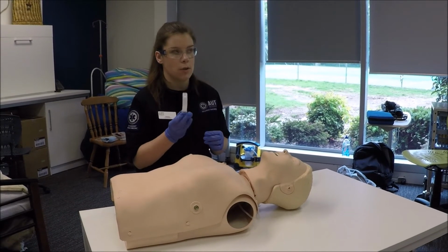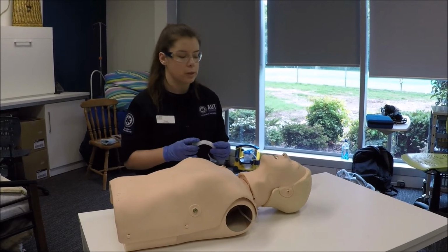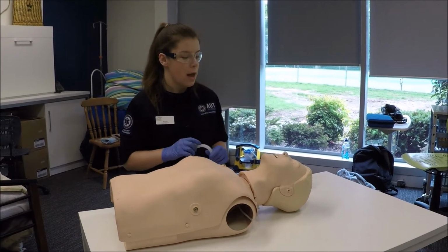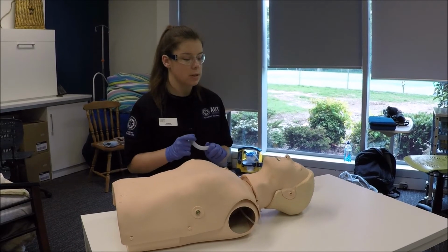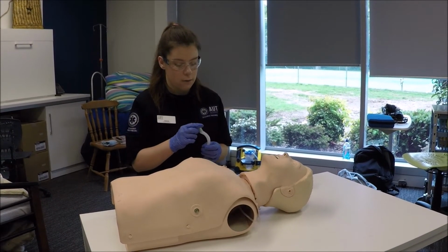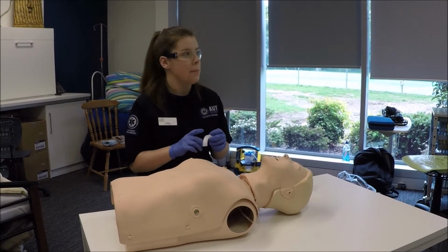Some contraindications of the OPA is if the patient still has an intact gag reflex, or there's any other obstruction that would make the use of it inappropriate, such as lockjaw. Some complications of the OPA is if the size is too big or too small, it can do damage to the oropharynx, it can induce vomiting, or can further block the patient's airway if there's already an obstruction there.